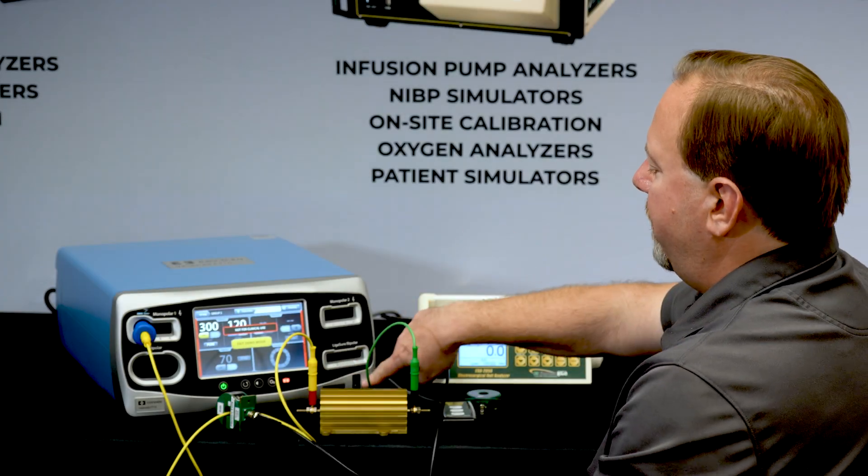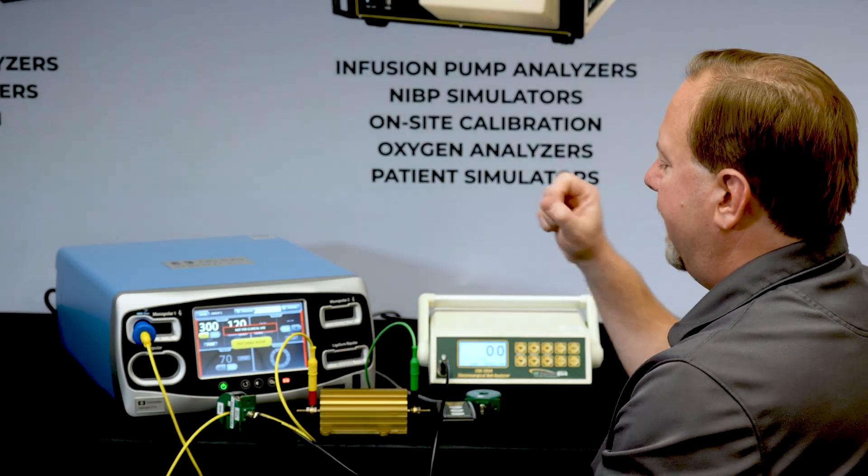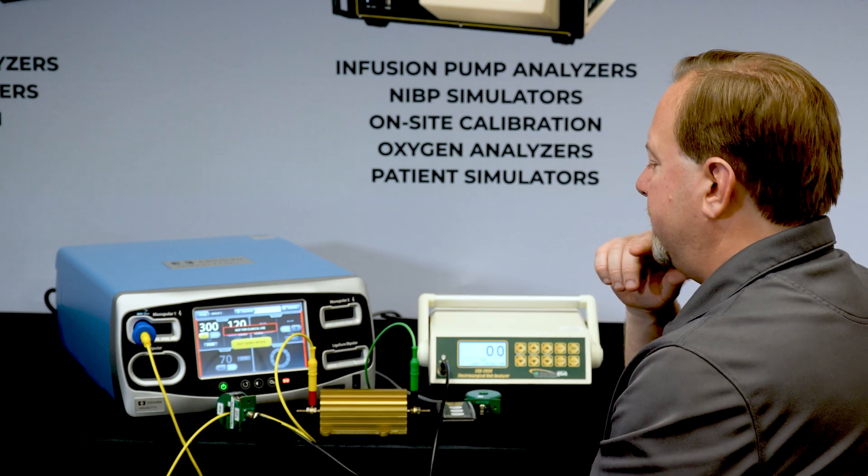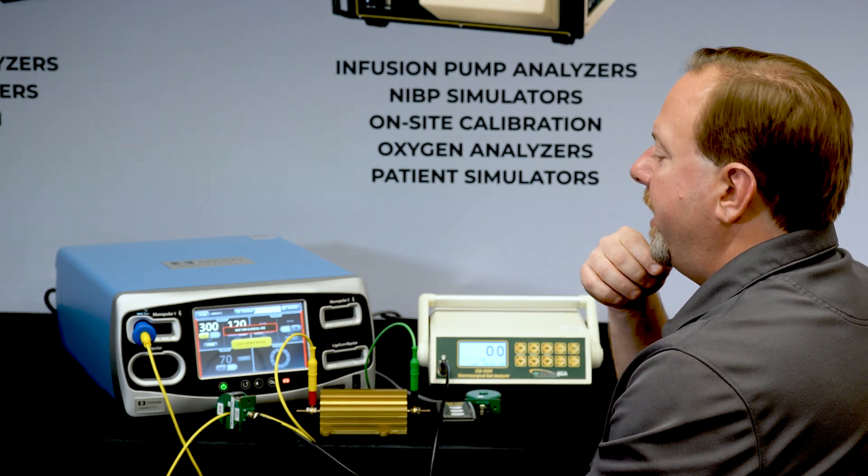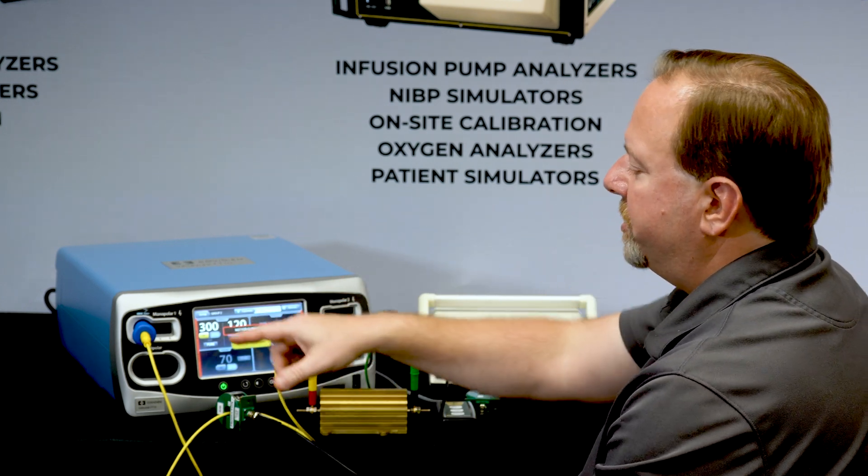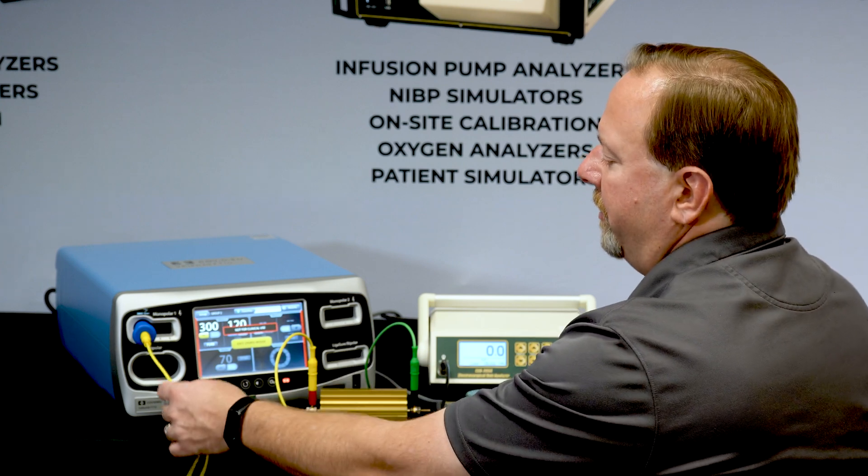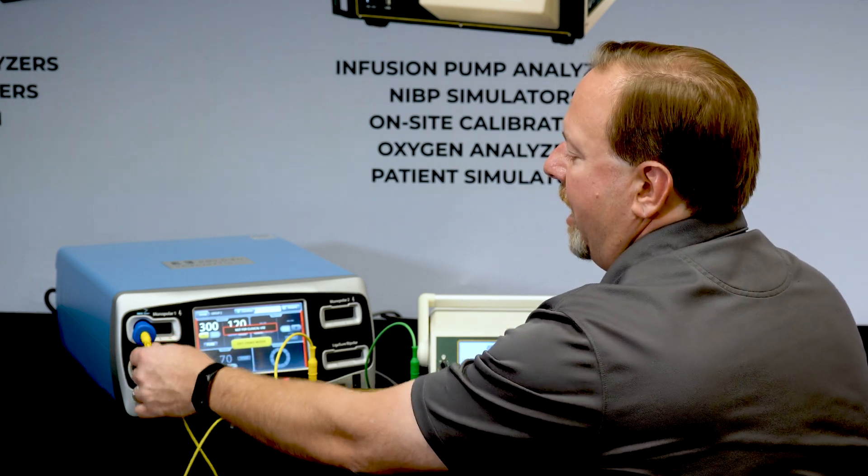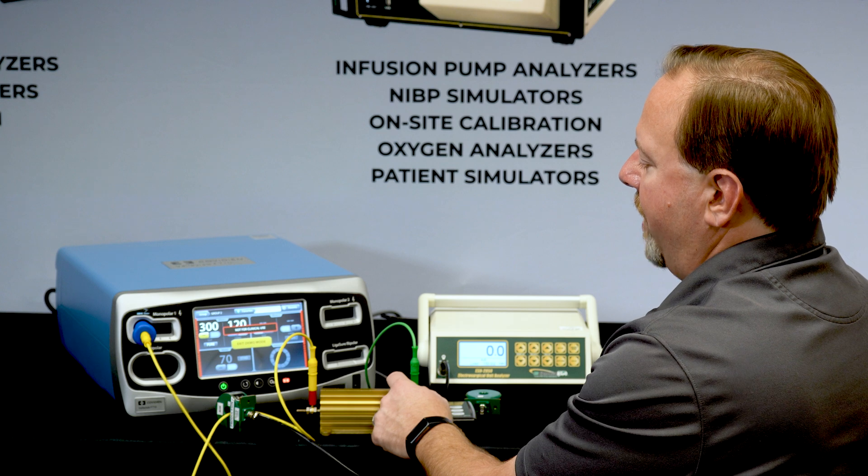So now we have our connections. Notice we don't have anything to the REM port. That's okay because we're in demo mode. It'll still let me trigger the generator. And what we're doing is we're measuring the amount of current coming from the output port to earth ground.